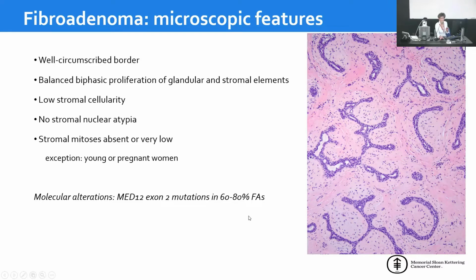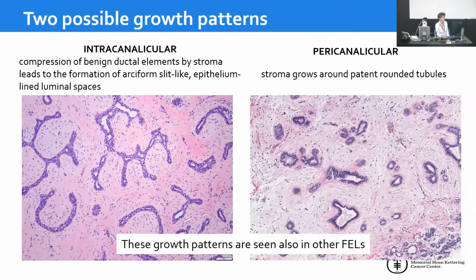This is a very unique type of alteration that, in solid tumors in humans, occurs only in leiomyomas and sometimes also in leiomyosarcomas, but it's mostly in leiomyomas of the uterus. So you can see some parallel already there between fibroadenoma in the breast and another spindle cell lesion that is hormone responsive in the uterus.